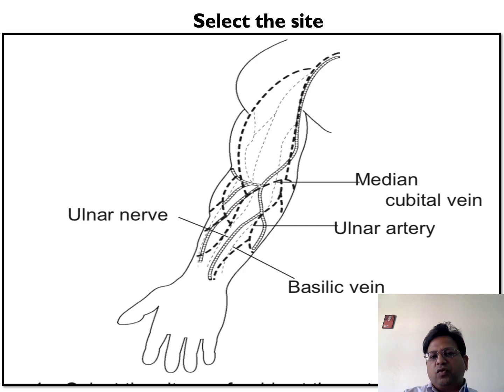What you will do in case of a hospitalized patient. In these patients, do not take blood from an existing peripheral venous access site, because this may give a false result, and this will nullify the whole exercise. Hemolysis, contamination and presence of intravenous fluid and medications can alter the results. So please be careful before taking the blood.